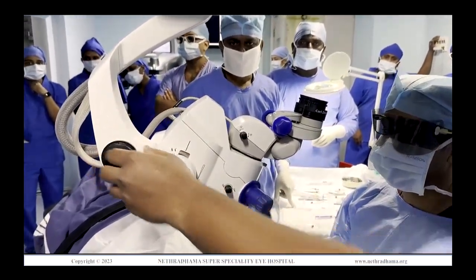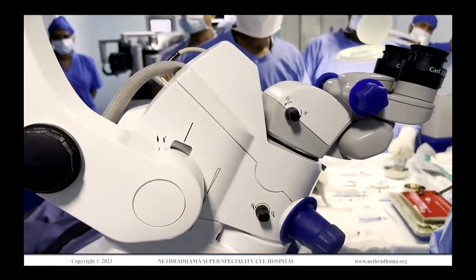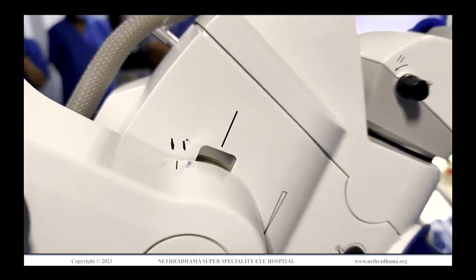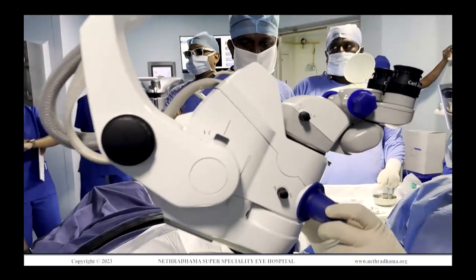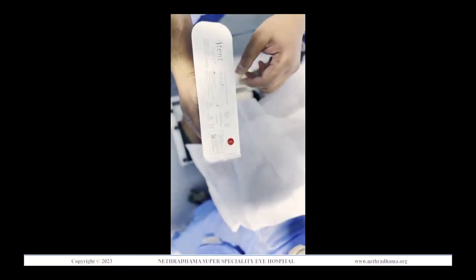The next step is to turn the microscope by 30 degrees. You can see that there's markings that are made, which are pre-made, and the microscope can easily be tilted to 30 degrees towards the surgeon, and the head of the patient needs to be tilted away from the surgeon.